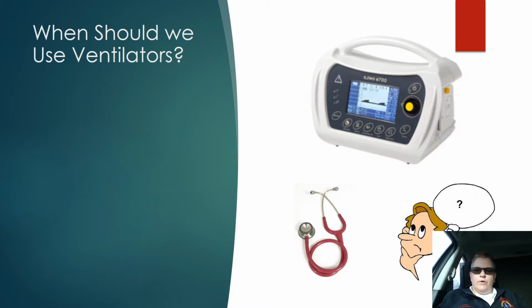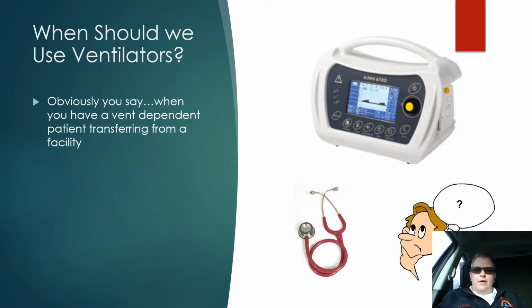Okay, some more. When should we use ventilators? So obviously, when you have a vent dependent patient, you're going to set up the vent for them. It's easier for them. So that's an easy one. How about post-ROSC? So you have an LMA placed. Do we always have to intubate? No. Can we put a ventilator on a LMA just like we do with the ET tube? Yes, we can.